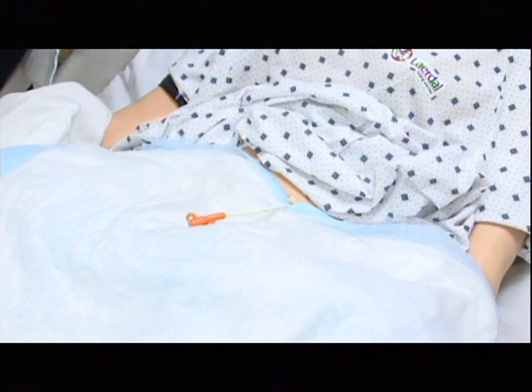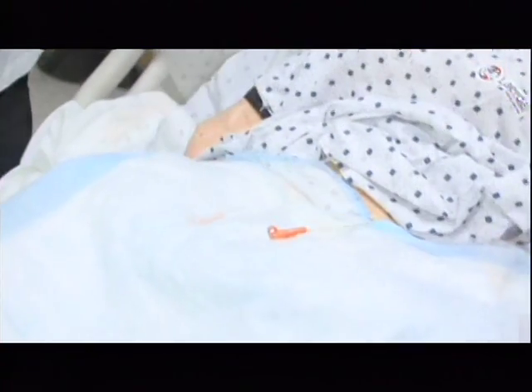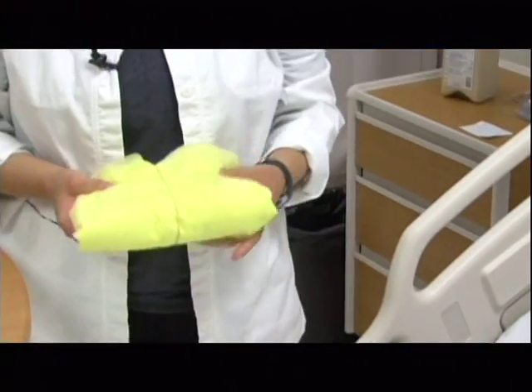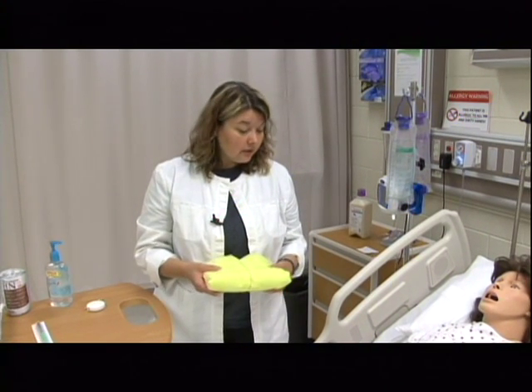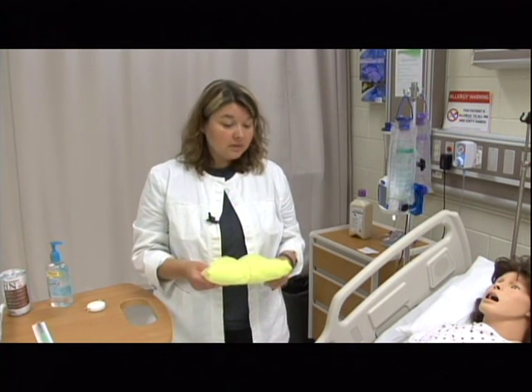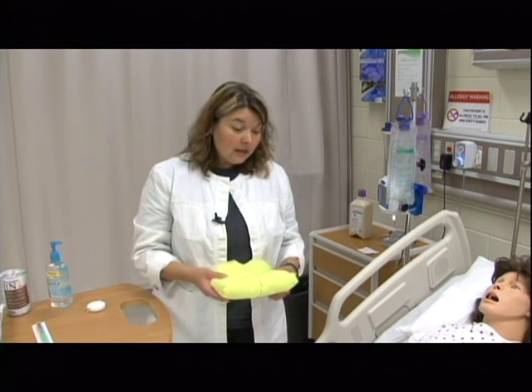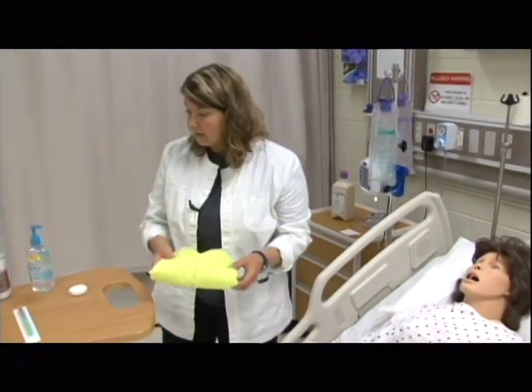Certainly I could have pre-medicated her if she was having any pain or nausea. If she had any abnormal assessments before I started with the feeding, it might warrant that I call the physician if she had abdominal distension or was not feeling well, because that might warrant holding the tube feeding. At this point, if I needed personal protective equipment, I could put this on. If Mrs. Smith's condition had warranted personal protective equipment, certainly I would have entered the room wearing it if she had MRSA or VRE or C. diff or any of those things. But if it was not needed, I could choose to wear personal protective equipment at this point if I wanted to. Sometimes I will wear it because you can end up having splash or leakage or something like that.